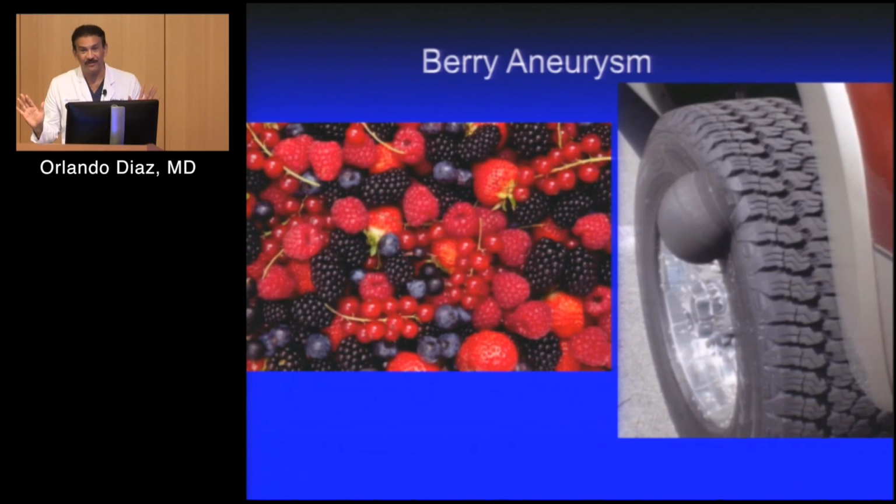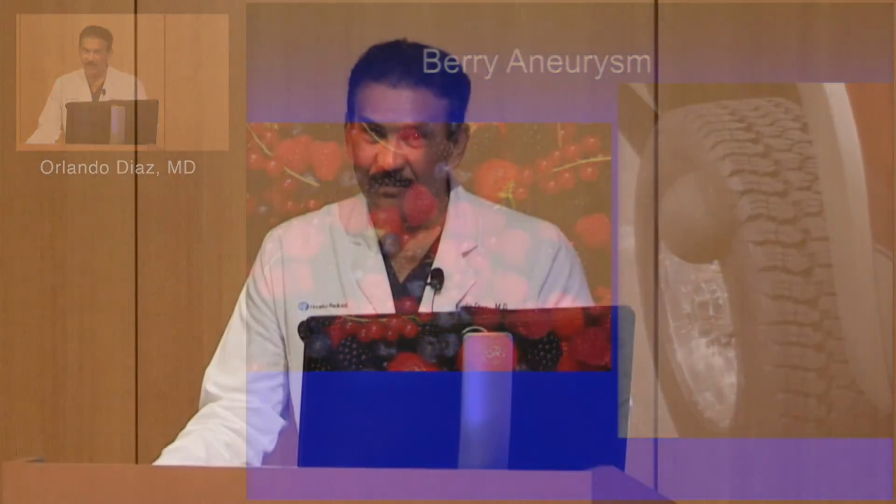Don't touch this patient. You're not going to get the patient better. But still, we're in the process to develop, to do it very quickly. But my personal opinion is that we should do it in those cases that we don't know, doing perfusion and diffusion, and see what is the area of penumbra. If the area of penumbra is more than 100 cc's, it's worth it to go.